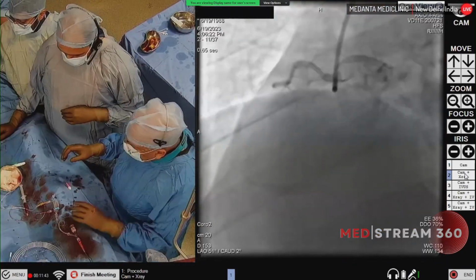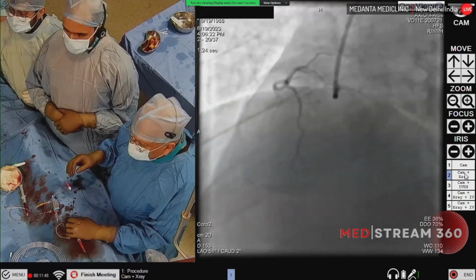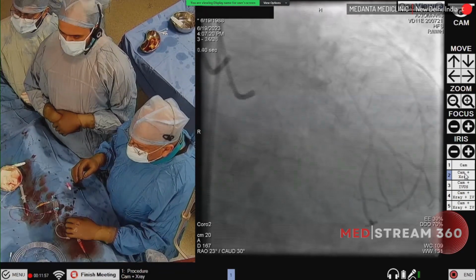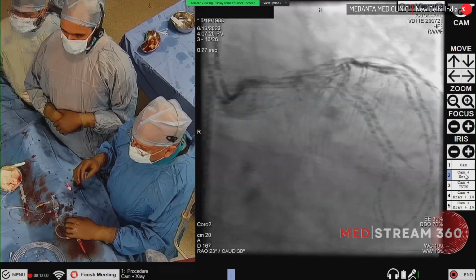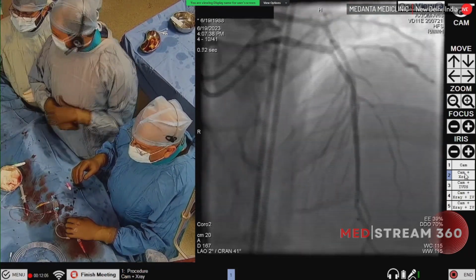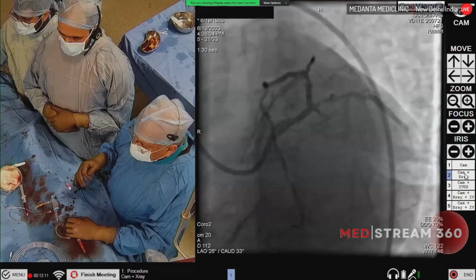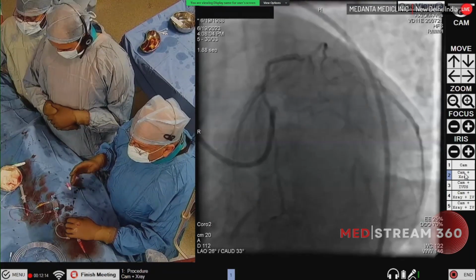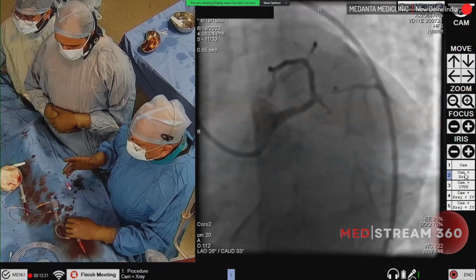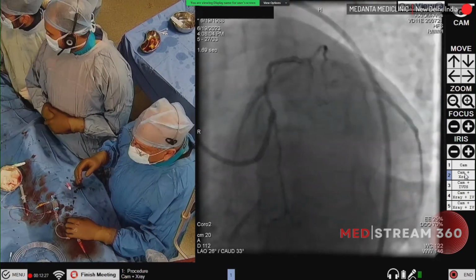So he has got triple vessel disease, and as you can see on the angio, the right coronary is totally occluded, and the left main has some plaque, but the tight lesion is in the ramus, which is like 90%. And then there is some disease in the LAD, which appears to be borderline. So at this stage, we were contemplating that, looking at his age, he's only 33, if we just do the two lesions, which is the ramus and the RCA, the circ is not a very big artery. We can leave the circ on medical therapy. And now we were doing the FFR.